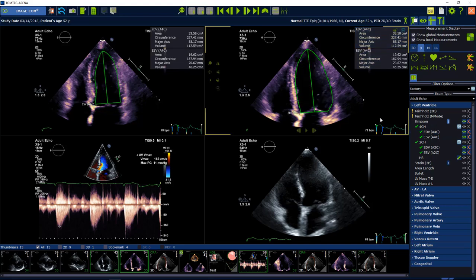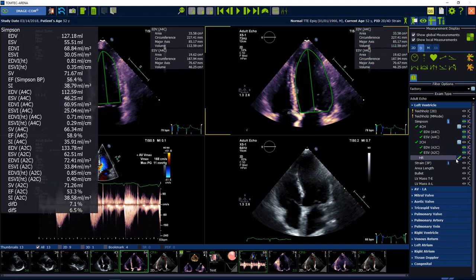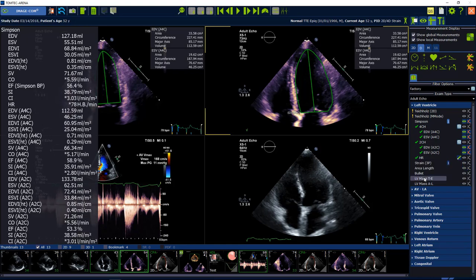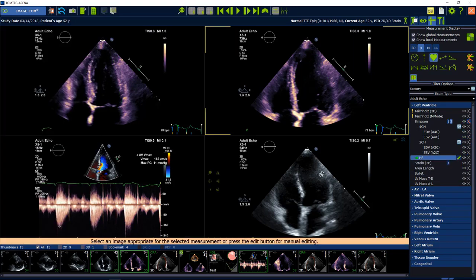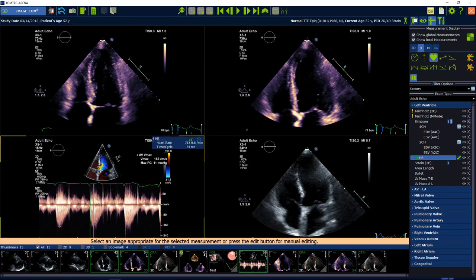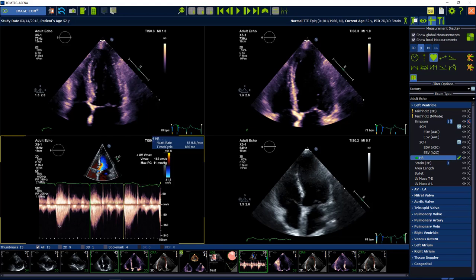The heart rate can be added to calculate the cardiac index either manually, just by adding the number, or you can also measure the heart rate in an M-mode or Doppler image. You just click in the image and then you can measure the heart rate.